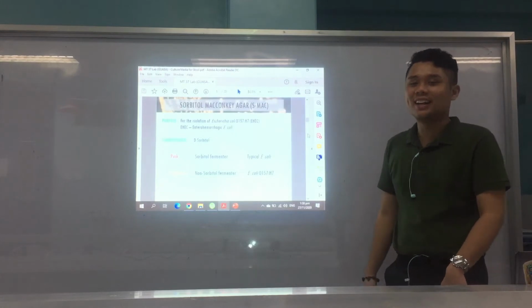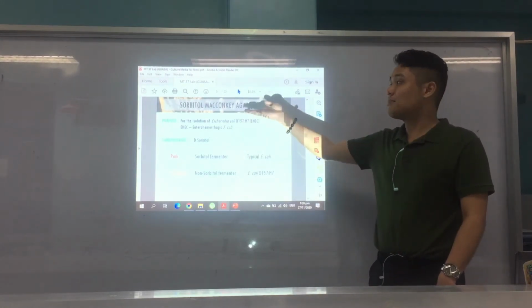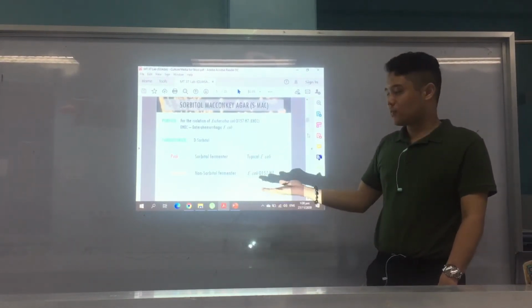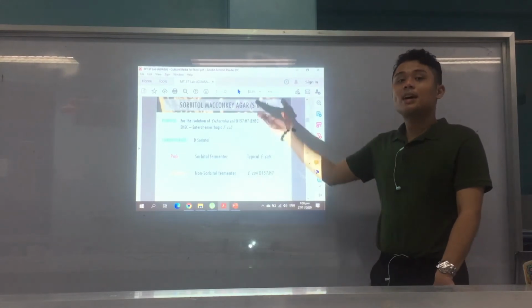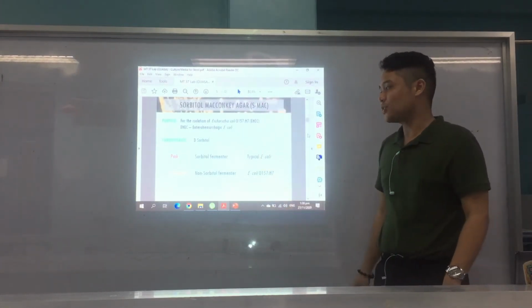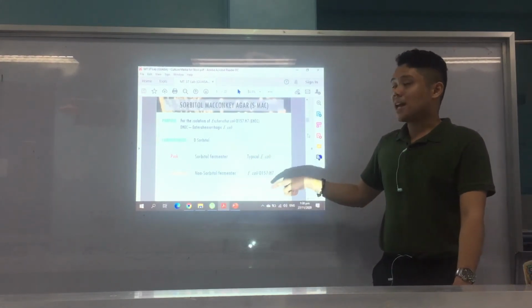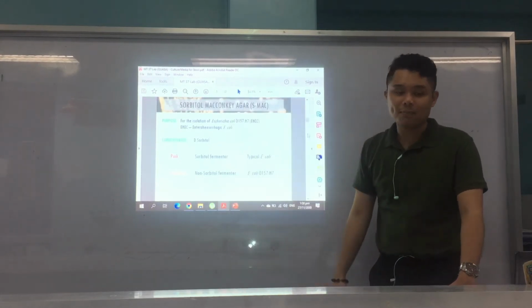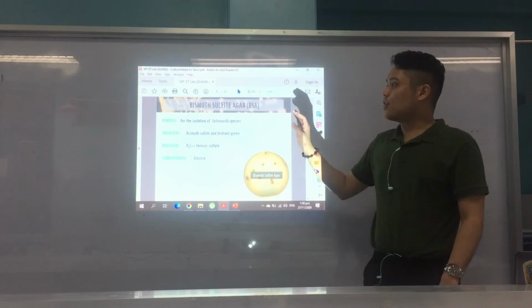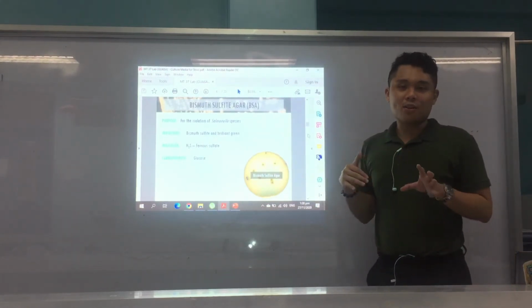Again, colorless colonies on your SMAC, E. coli O157:H7. And again, the culture media of choice for E. coli O157:H7 is SMAC. Okay, so these questions keep coming back. And the rest of your E. coli strains, of course, they ferment sorbitol, so they still appear pink on sorbitol MacConkey agar.